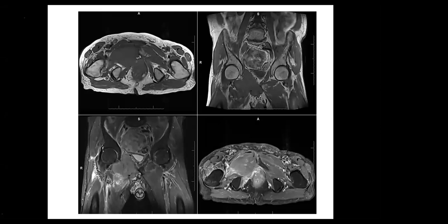And then at the end of the description, you should commit to whether aggressive or non-aggressive. And on MRI scan, again, a reminder that the MRI scan is done when we have an aggressive bony lesion on the radiograph, and the MRI is done for local staging. And if we are doing local staging on the MRI, then we should comment on the neurovascular structures, we should comment on the intra-articular extension, we should comment on the fat plane between the mass and the pelvic organs. So this is how you would normally describe the MRI scan in patients with an aggressive bony lesion.